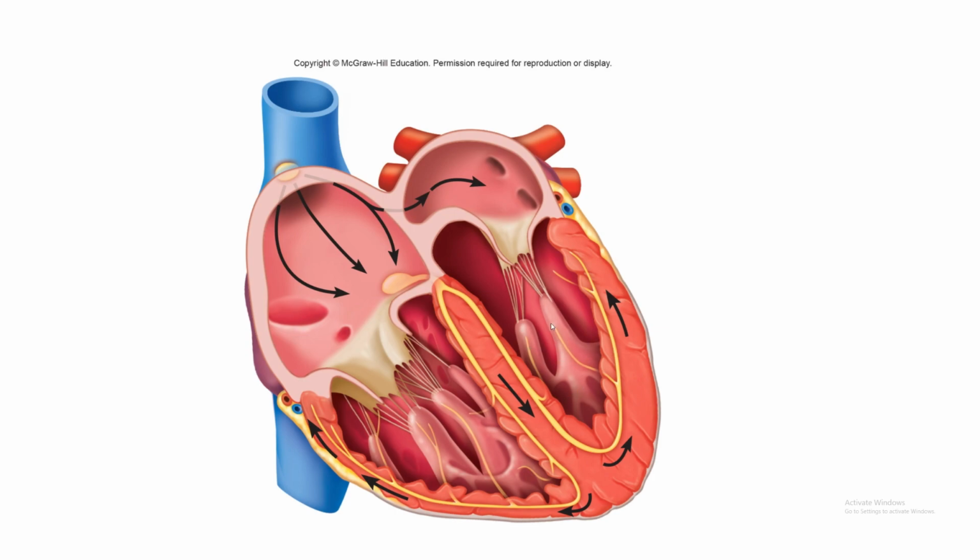Once all of this becomes more positive, again, we're talking about everything becoming more positive as an electrical signal is created. All of these cardiac myocytes are becoming more positive, right? That is depolarization again, as we talked about, and that's going to cause ventricular contraction. And how you see ventricular contraction in reference to your 12 lead is your big QRS, your big spike, essentially. The QRS is ventricular depolarization, which signals ventricular contraction, right?